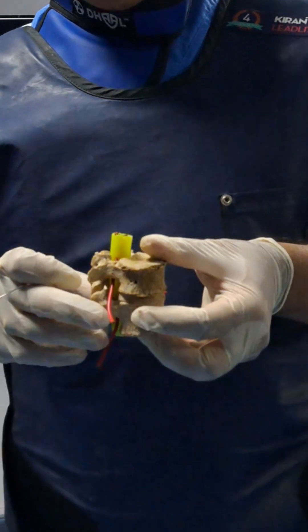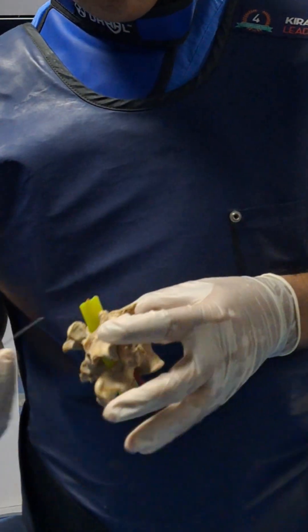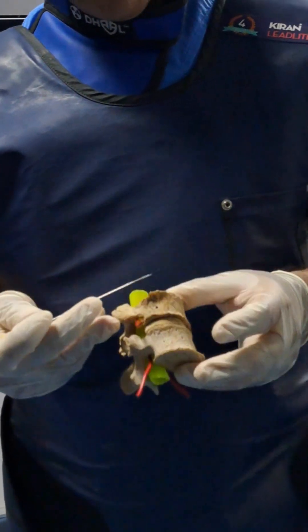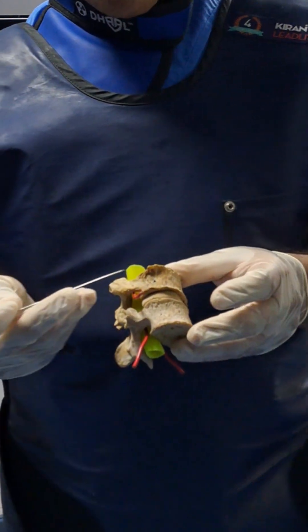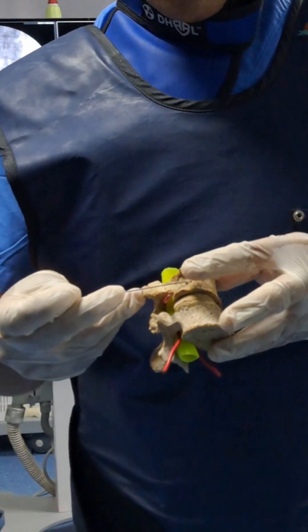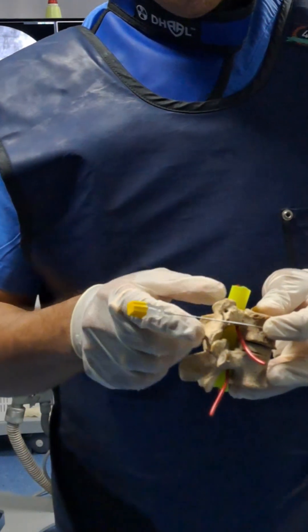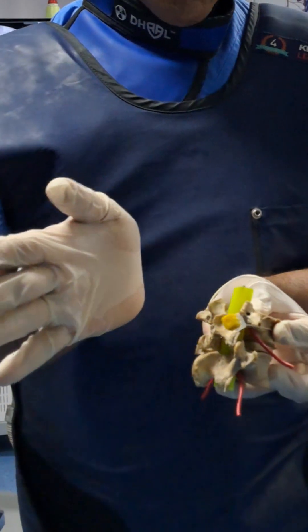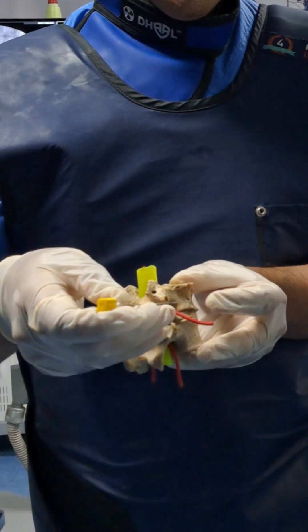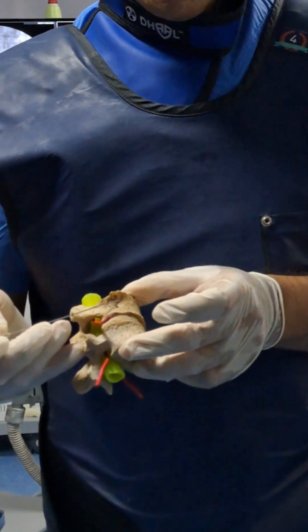Regarding the trajectory, if we look at the transverse process — the stalwarts who developed this technique established that to reach the antero-lateral border, the trajectory usually matches with the transverse process. So if I take the C-arm oblique enough so that the outer border of the vertebral body is touching the outer border of the transverse process, you will reach at this level.